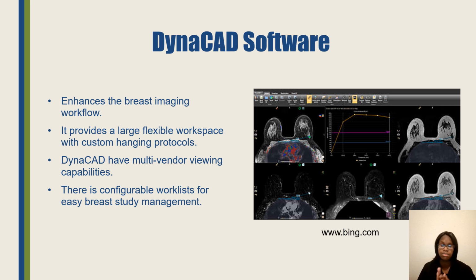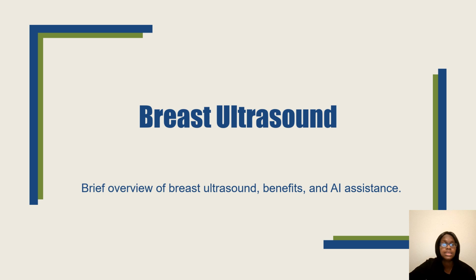We send a lot of the breast MRI images to DynaCAD, so it enhances the breast imaging workflow. It is helpful for radiologists. I know when I work in MRI, we send our images to DynaCAD, and the radiologists also view it, or they do whatever they need to do on the DynaCAD software with the breast MRI images.